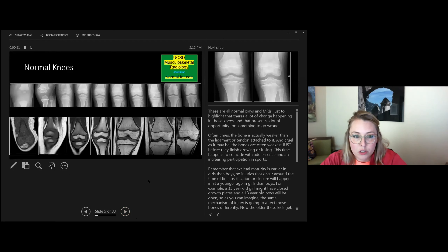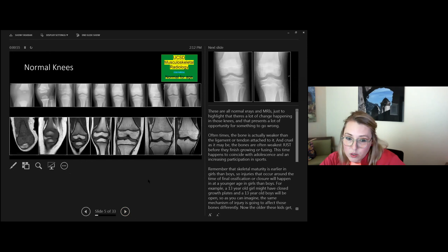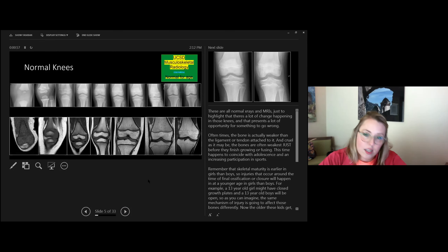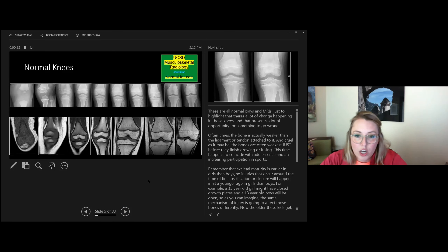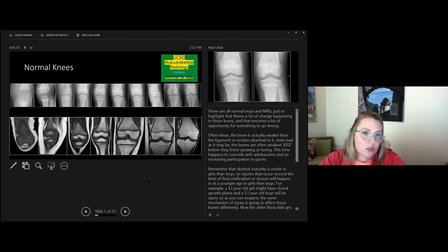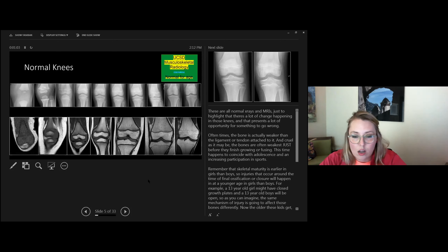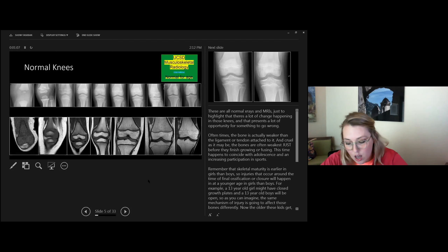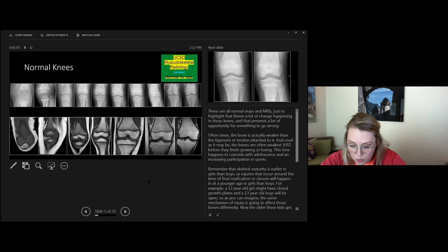These are x-rays and MR images of kids from birth to 18 years old, and these are all normal knees. This really highlights that there's a lot of change happening in these knees, which presents a lot of opportunity for very unique injuries and injury patterns that we see in our teenagers, particularly those that participate in sports.